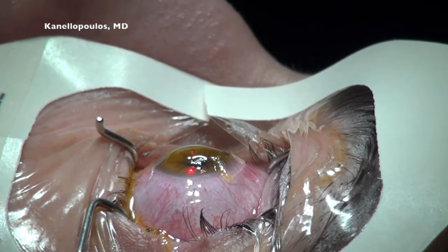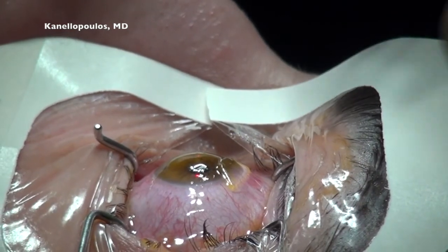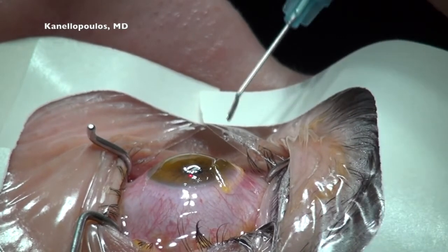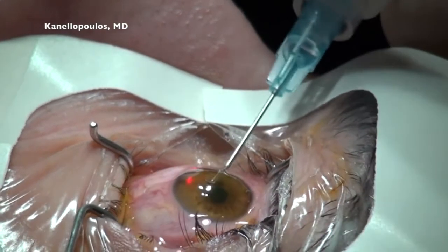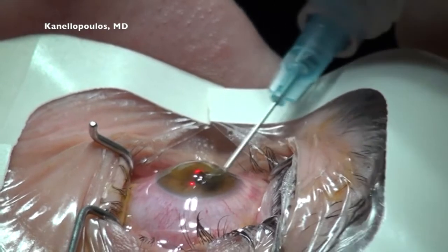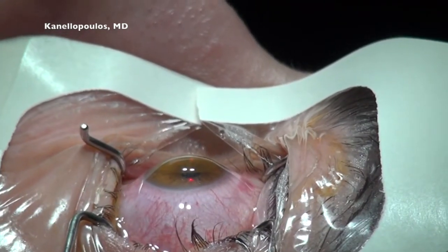And we will, in this way, increase the biomechanical strength of the cornea, which by LASIK has been reduced by at least 20%. So here we're going to replace the flap in position, rinse away the redundant riboflavin solution, and finish the procedure as if we were not going to do adjunct cornea cross-linking.